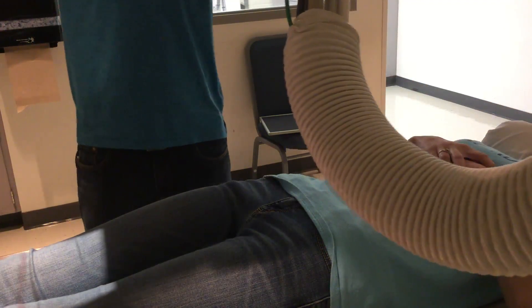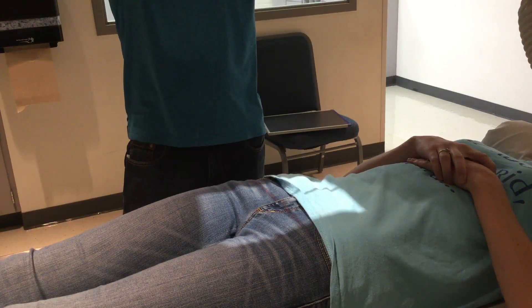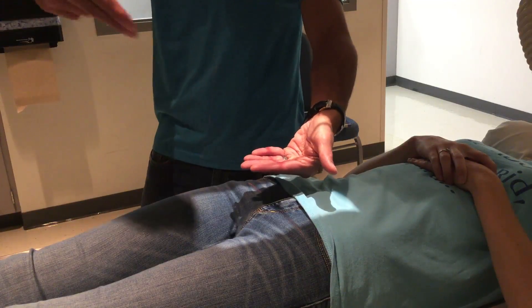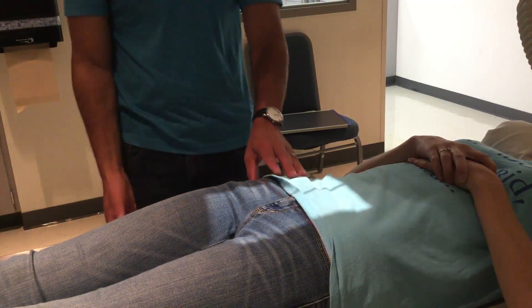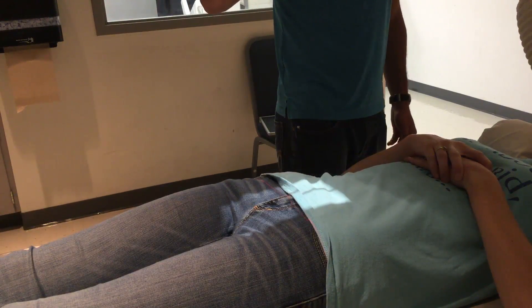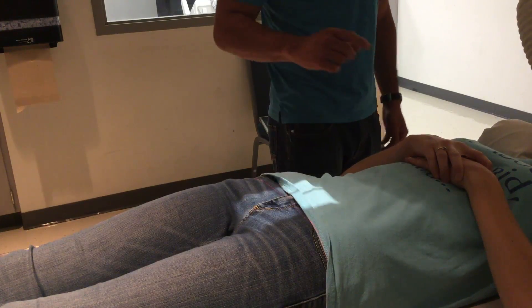The coccyx is pretty straightforward — basically the same picture with a different angle. That's because your sacrum and coccyx sit curved in. For the sacrum you're angling in like this; for the coccyx, the opposite way. So approximately 10 degrees — won't be perfect. ASIS, two inches below. You want to get the tailbone. On this one it's nice to collimate a little bit more — you want that contrast and the coccyx just isn't that big, so this helps quite a bit.